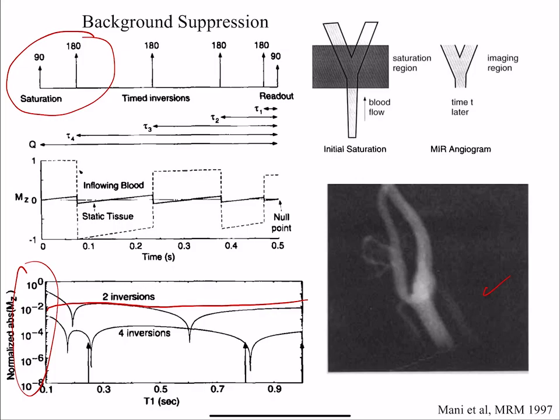Okay. Yeah? So for example, if you were allergic to the dye, you would need to do this CT. Was this a viable option to do with MRI instead? Yeah, we'll show some examples later. So non-contrast angiography is used quite a lot, although there is also something called contrast angiography, where we do use agents in MR to reduce the time and increase the signal. But the problem is some of those agents have been found to actually have bad effects, especially I think on kidneys and something like that. So there is a push: the more you can image people without agents, the better off you are.